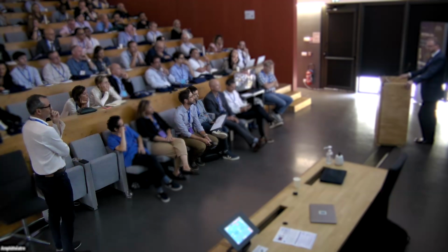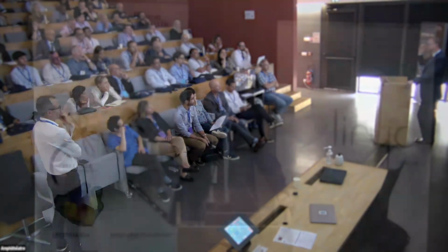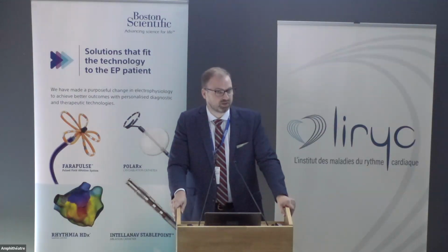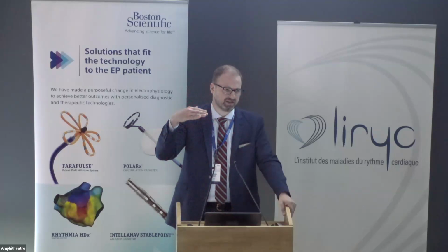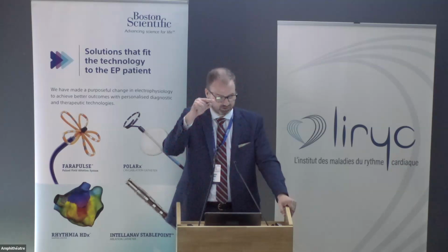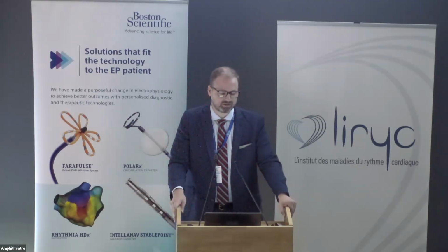Broadly speaking, I don't think we will ever get there. What you see now on our generator is effectively one button, and underneath there's like 200. It's completely understandable to want to know more of the details, but we certainly wouldn't want to be playing around with those settings, because it took months and years to optimize that to not have the bad things happen, not necessarily to make the lesion better and better. If you start playing with that, it's amazing how quickly we get out of that little sliver of a design space. That's why I wouldn't even be comfortable being handed a competitor's catheter. I would have to derive the waveform.